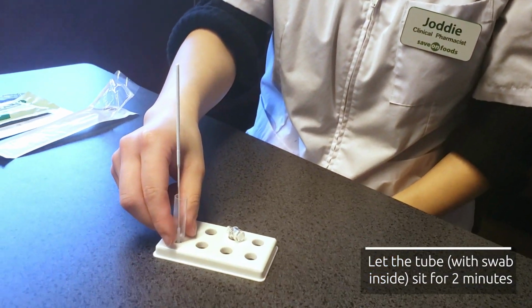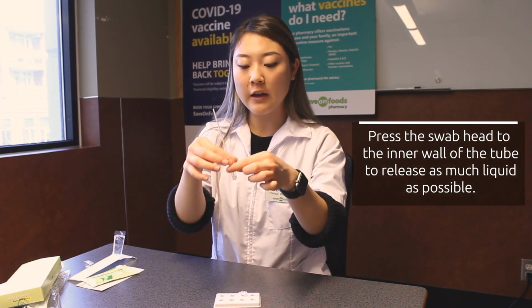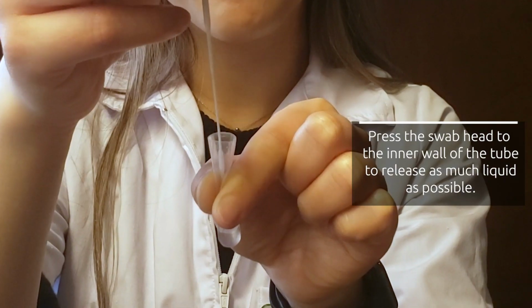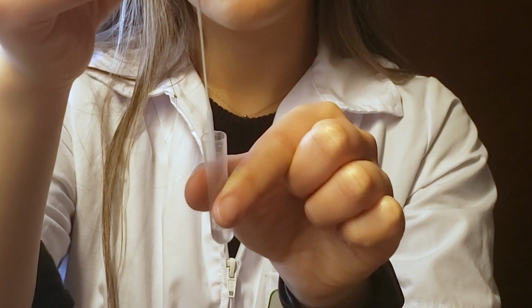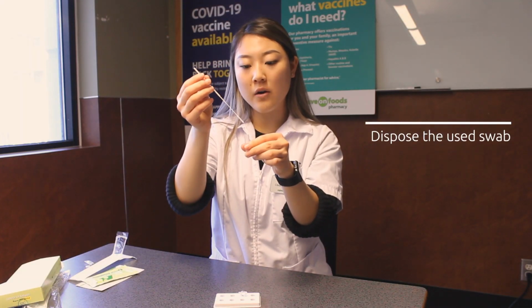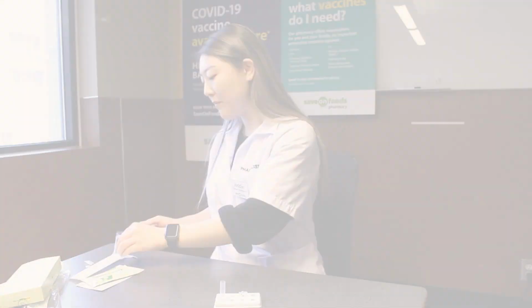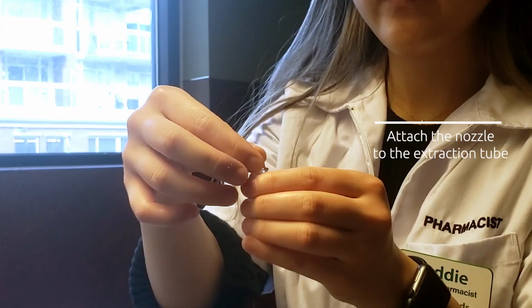You want to let this sit for 2 minutes in the test tube rack. You want to make sure you get all the liquid out of the nasal swab by pressing on the extraction tube to squeeze out all the liquid. And now you can put the nasal swab into the garbage can. You want to put the nozzle cap onto the extraction tube.